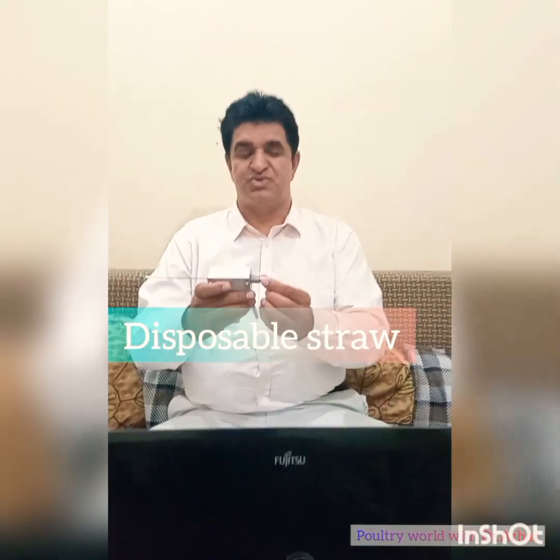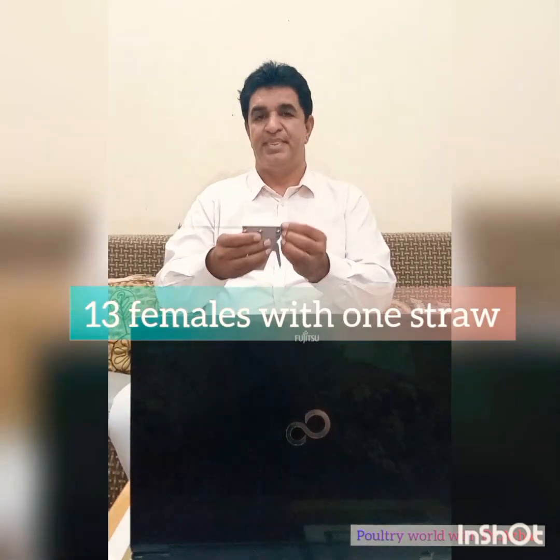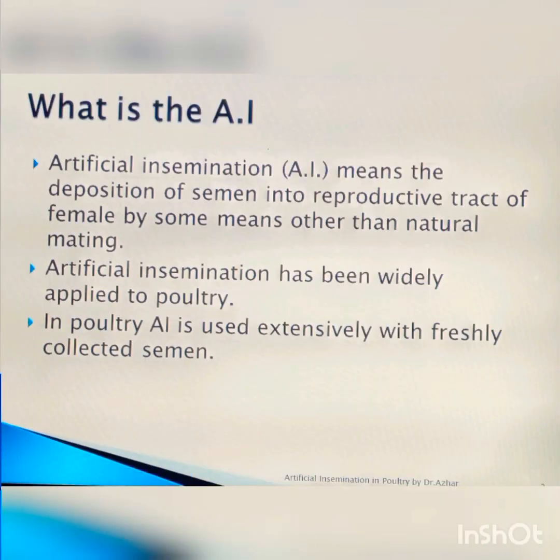This gun is used with a disposable straw, and 13 females can be inseminated with one straw. Artificial insemination is the deposition of semen in the reproductive tract of females by means other than normal mating.